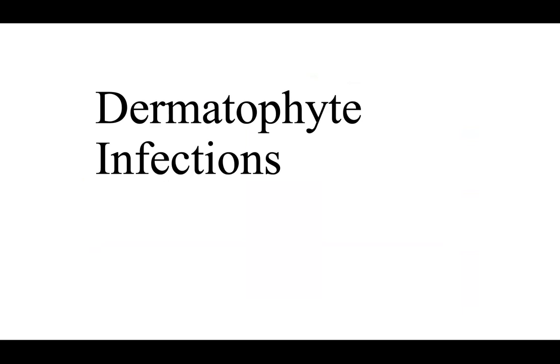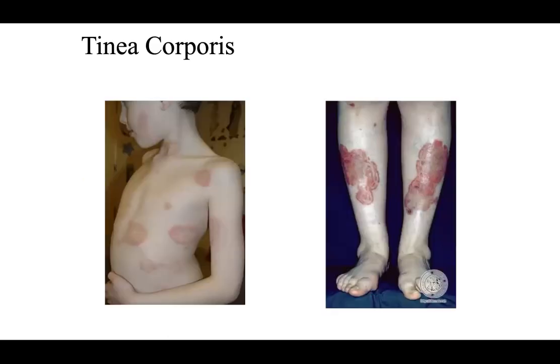So many times reports will be signed out as spongiotic dermatitis, and then an addendum will be reported to confirm it was negative for GMS or PAS, to show positivity or not. If it was positive, then the diagnosis would actually change into dermatophytosis, and the spongiosis is a result of the dermatophytosis. So here, clinically, you'll see well-demarcated scaly papules and plaques.